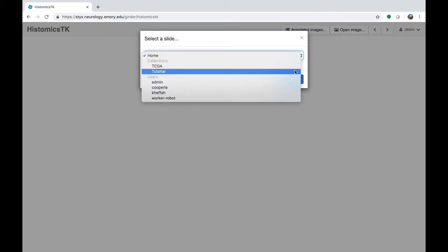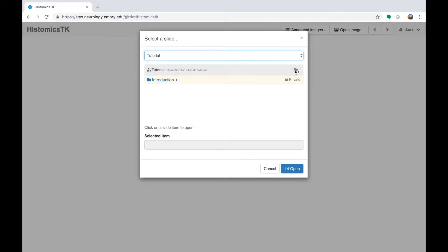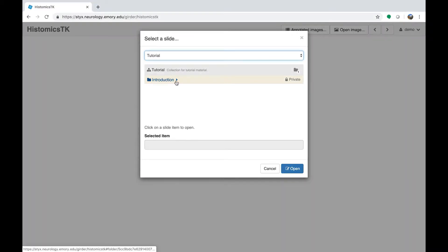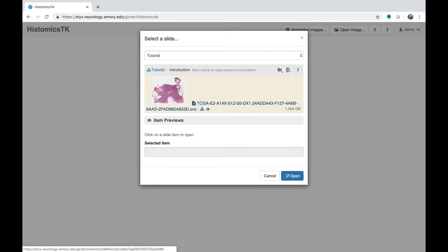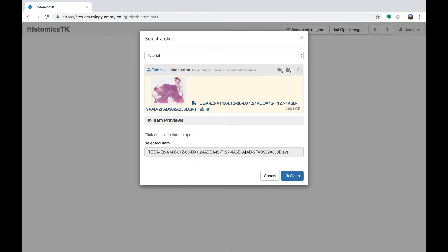Clicking Open Images raises a menu showing what collections you have access to. If you click on the tutorial collection, you'll see there's a single folder. Folders are used inside collections to organize slides — you could organize by cohort or stain type, and slides can be organized automatically based on metadata. Click the folder to reveal the images inside. There's a thumbnail overview so you can see the tissue. Click the file name link to populate the load image dialog, then click Open to load the image into the viewport.